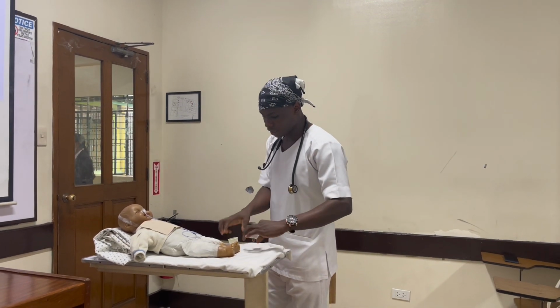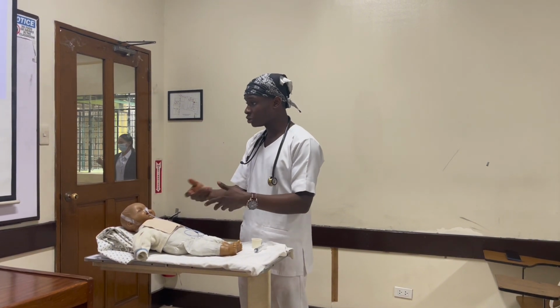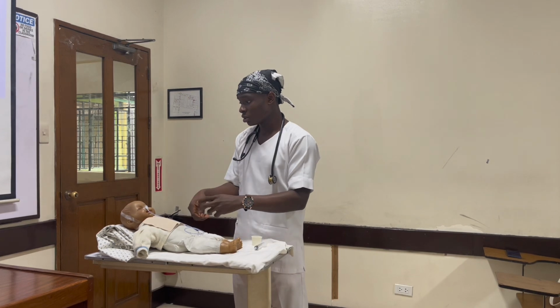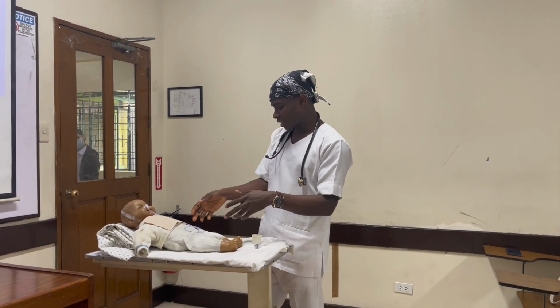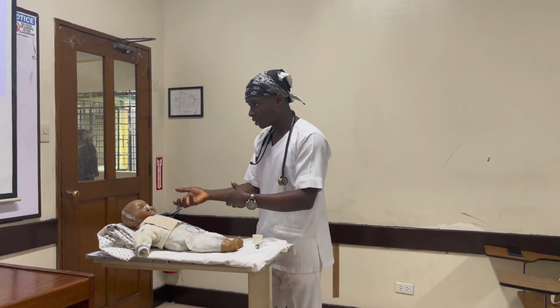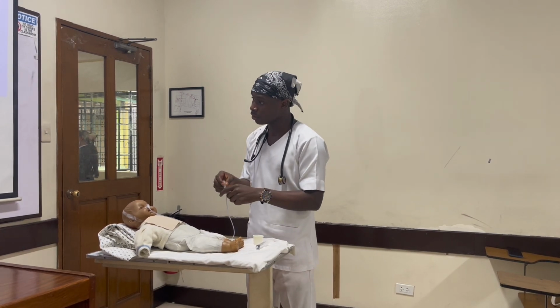While feeding, I should check for feeding intolerance in the baby: how the baby is responding and how difficult it is for the milk to flow in. In this procedure, some nurses might facilitate burping, but since I kinked effectively, there is no need for burping.